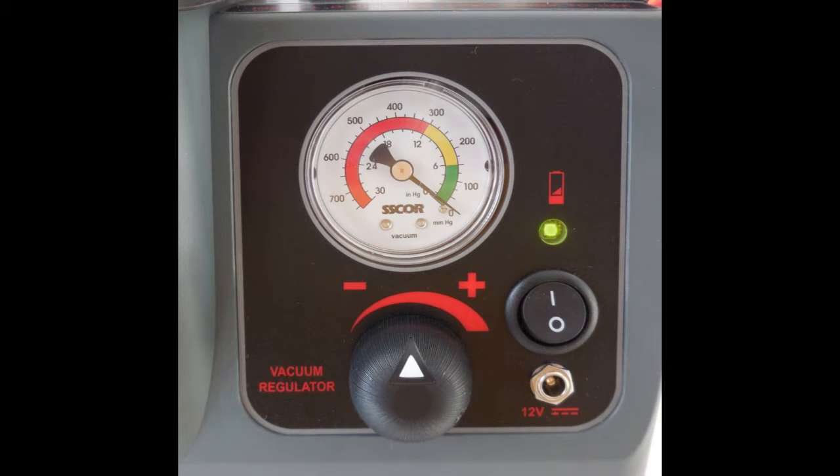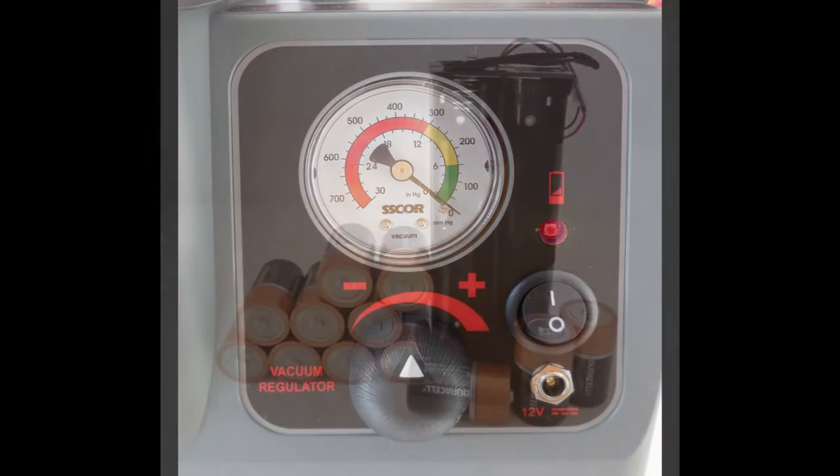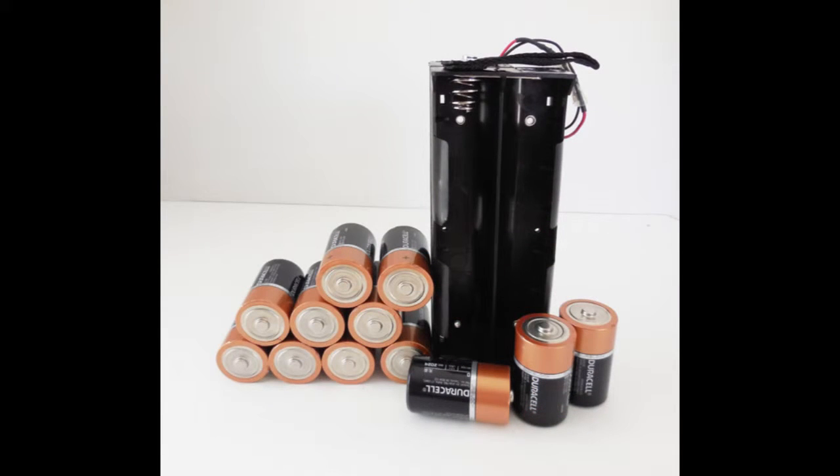The green LED indicates a high level of charge. The red LED indicates the battery voltage is nearly depleted and the negative pressure level of the device will soon be below 300 millimeters of mercury. Immediately install fresh batteries into the battery holder or connect the device to an appropriate 12-volt DC power source.